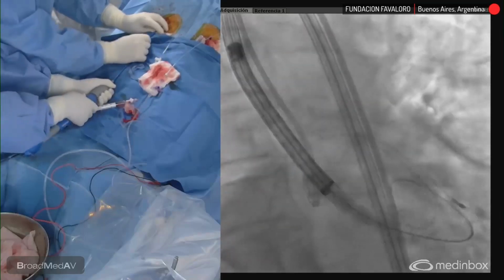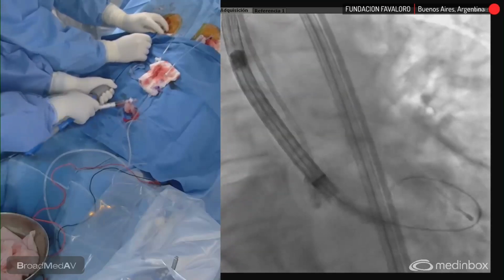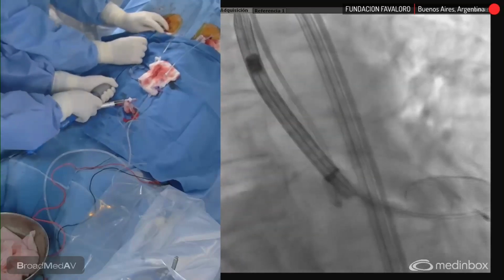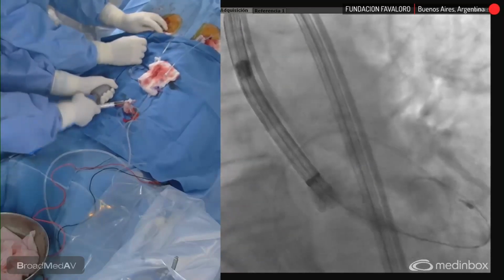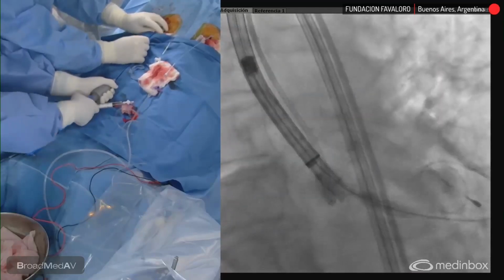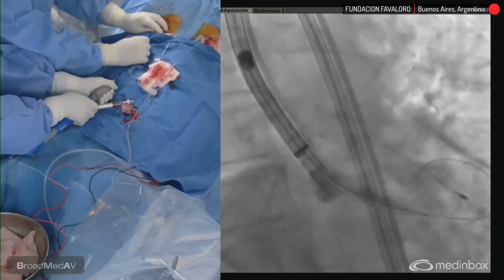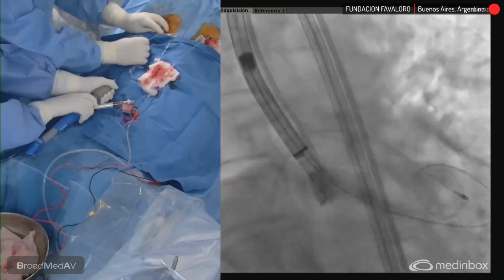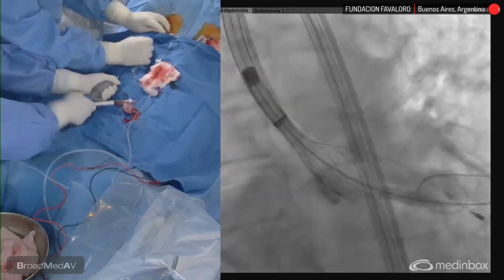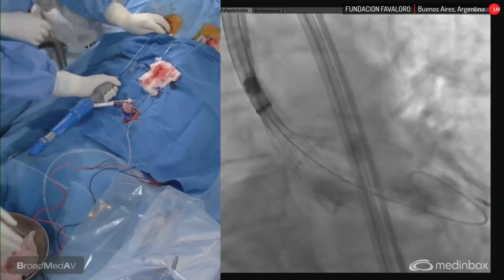I'm going to try to go higher here because we have the angulation, but slowly, very slowly. We have a good positioning of the delivery system, positioned against the external wall. 120. We were very careful with the pacing. Wait a moment. Yes. Okay, let's go. The blood pressure goes down with the pacing, probably due to her hypertrophy. So decrease pacing very slowly.